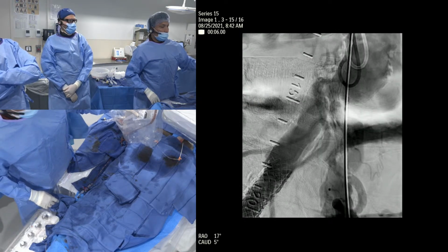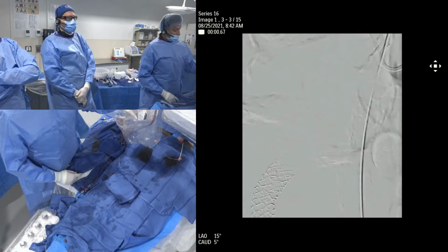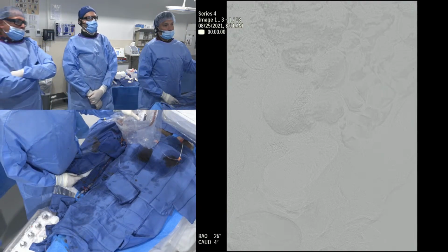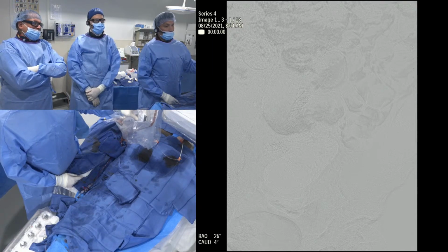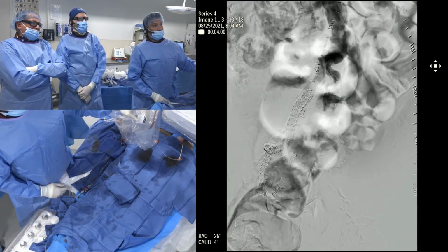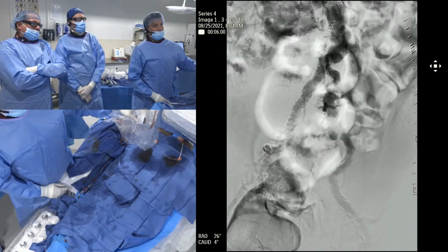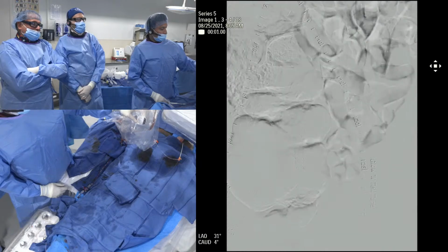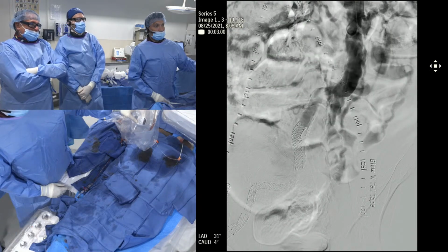So C minus, guys, hold on, I'll tell you. VBX 7.0, yeah, 59, that's what I'm thinking. Yeah, so here we go. This is going to help you a lot, because it's going to tell you what the status of the internal iliacs is and what you are going to do. So right now you don't have to worry about internal iliacs on either side, which is wonderful, which is bad for the patient, but good in terms of his safety for the intervention.